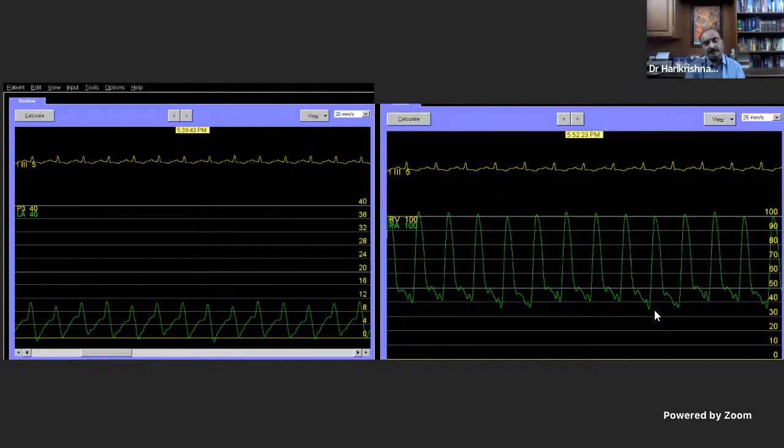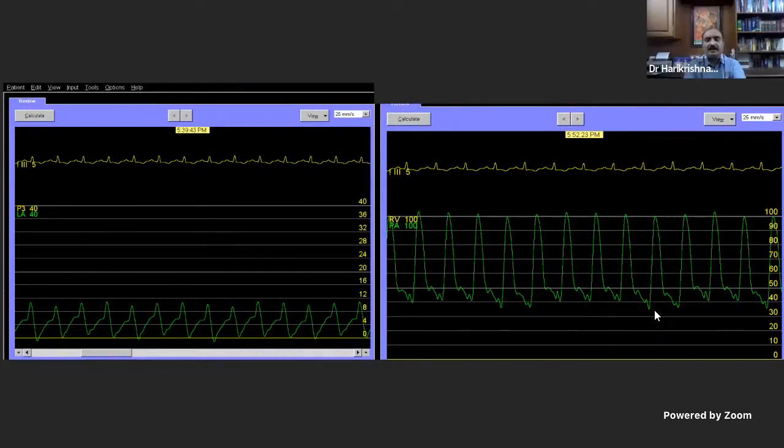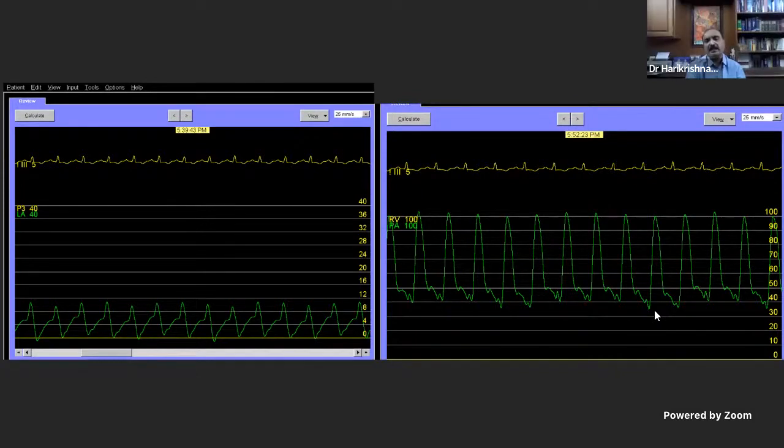Okay. What is this one? Discuss in the same lines. Instead of pulmonary capillary wedge, what is given? You see, what is on the left side? LA, then PA. It is given instead of the pulmonary capillary wedge. We are looking at the left atrial pressure only. So what is the left atrial pressure? LA pressure peak is 12 and diastolic is 0. So its mean is around 6 or 8.